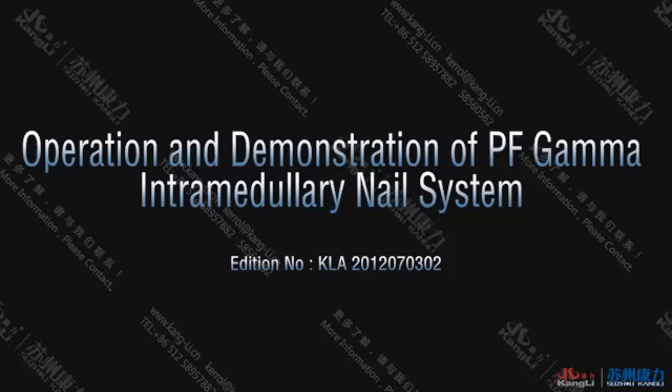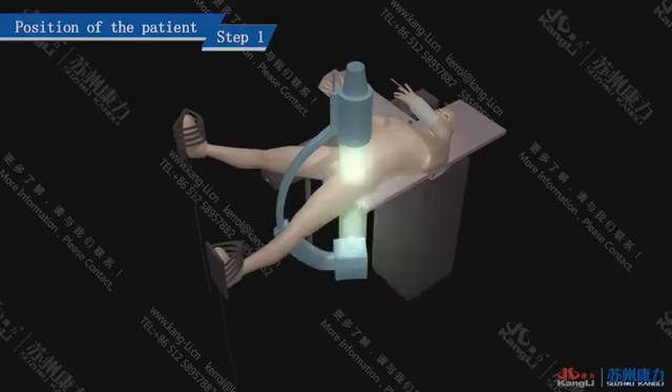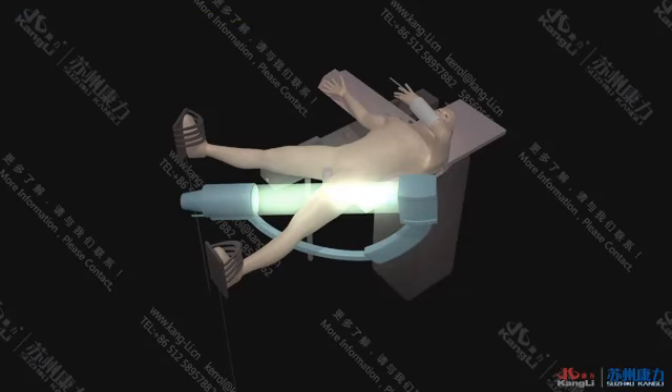PF Gamma Intramedullary Nail System. Step 1: Position of the patient. Place the patient on the Therapeutic Traction Bed in the supine position and monitor the surgery with fluoroscopy.